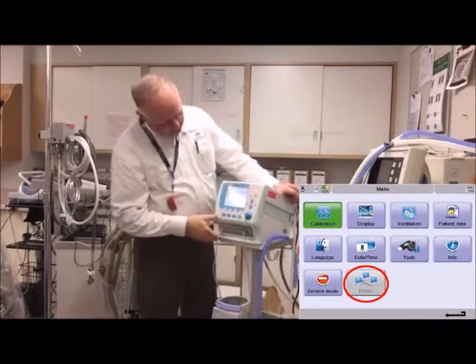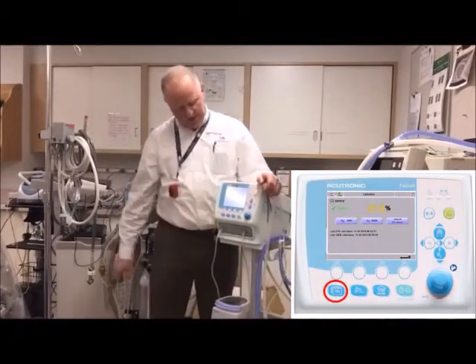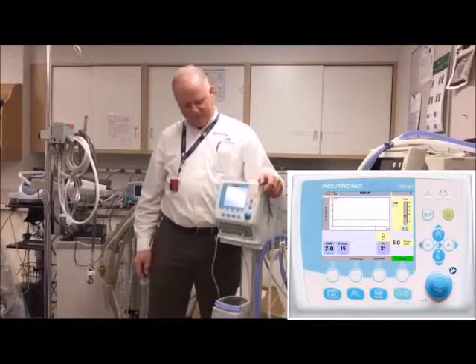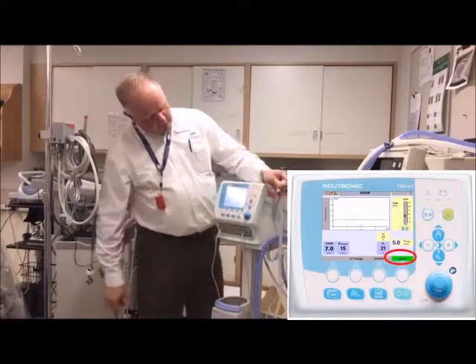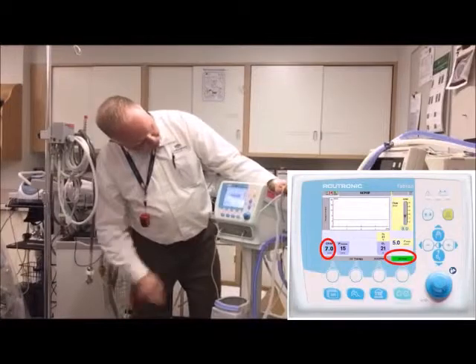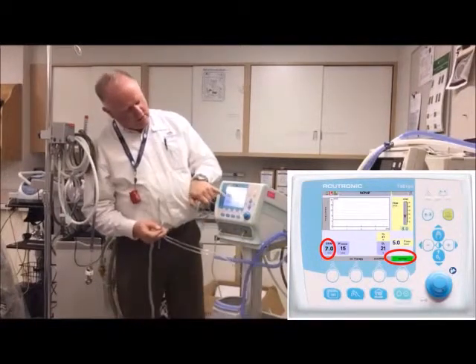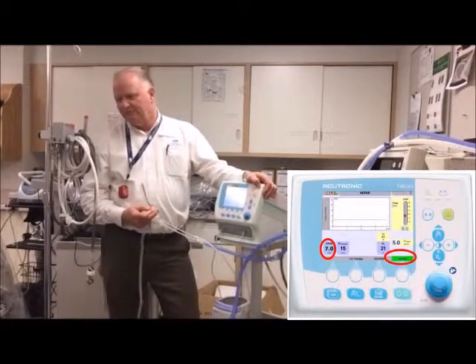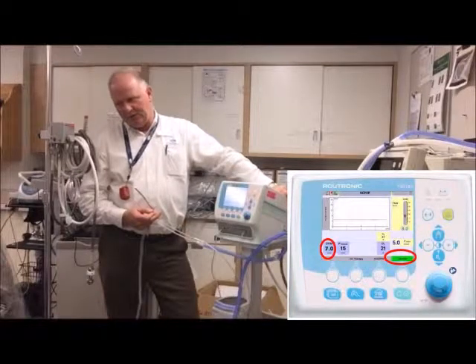That's pretty much that screen. Remember, when you first go in, it'll probably show the oxygen calibration — just hit it again. The home screen is the one you'll play with most. Here's your normal setting: we'll put it on nasal CPAP at seven centimeters. The baby's breathing along at seven centimeters — if the baby opens their mouth, there's a leak and the pressure drops. The device bumps the flow up and brings it back to seven, which is pretty nice.